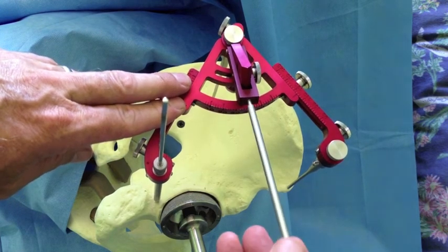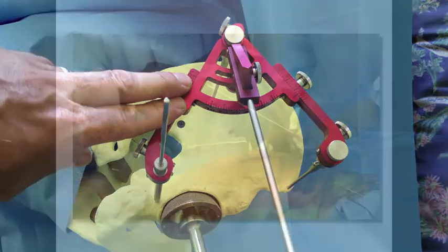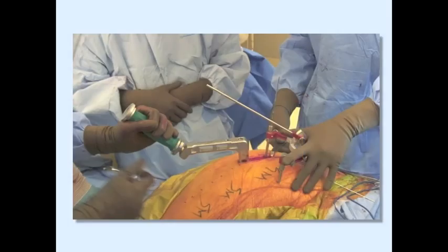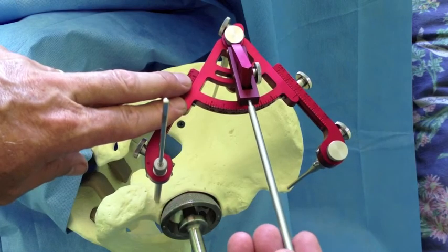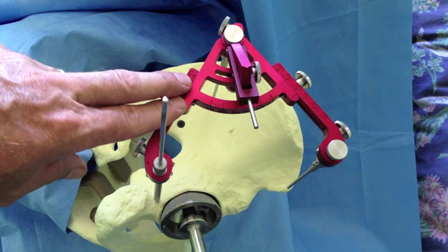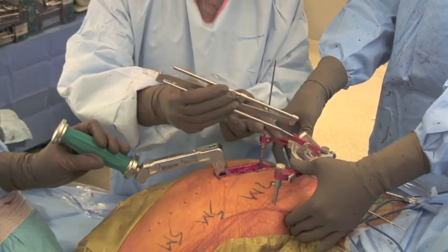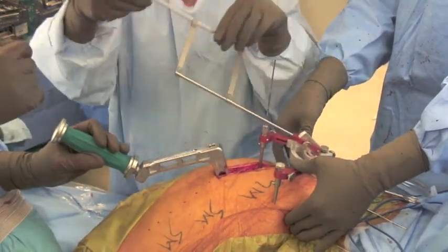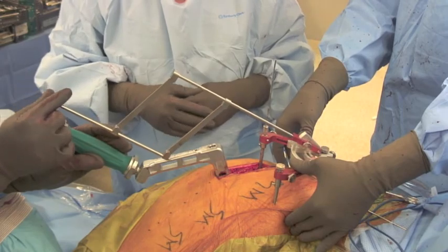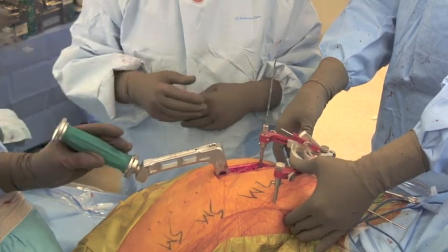Place the direction indicator onto its supporting pin and begin to align and insert the cup. Placing the cup handle parallel to the direction indicator controls both anteversion and inclination. It is best to remove the direction indicator when you are using the mallet so that it doesn't vibrate too much. Once the cup is approaching the final orientation, you can use the parallel guide instead of the direction indicator to be certain that your cup orientation is as accurate as possible.